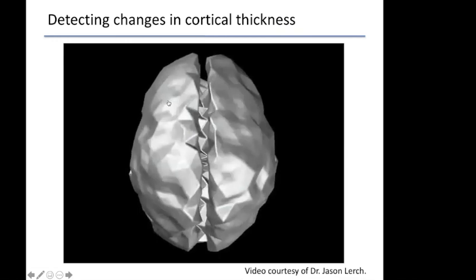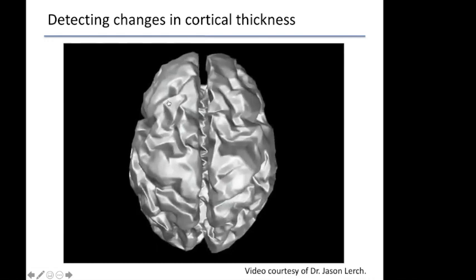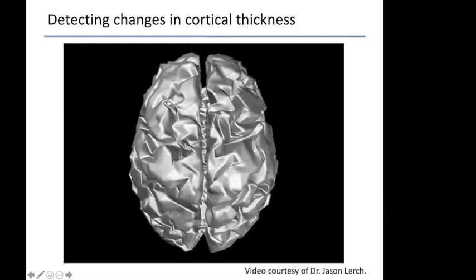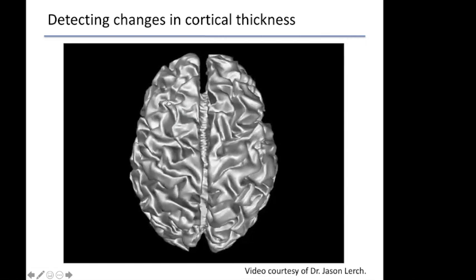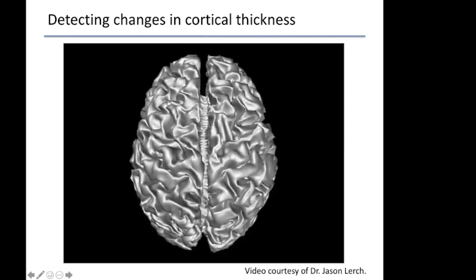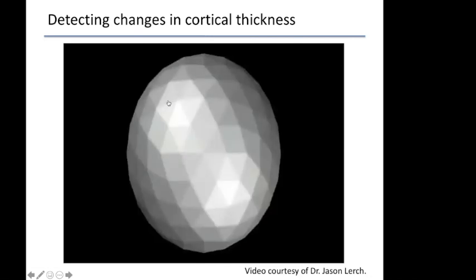And the way that works is that you ask them to do that annealing process over a number of iterations, and when you meet a stopping criteria, you add more points and hence more flexibility to the topology of that surface until you get this kind of crumply, more refined alignment to the white matter surface that you see here until you meet a stopping criteria. And so once you have your white matter surface, you grow that out to look like the gray matter surface. And once you have that, then you have your cortical thickness map.